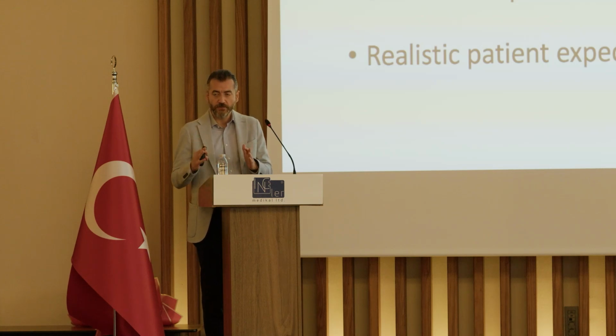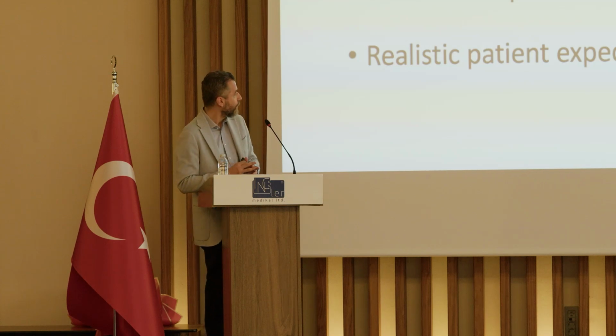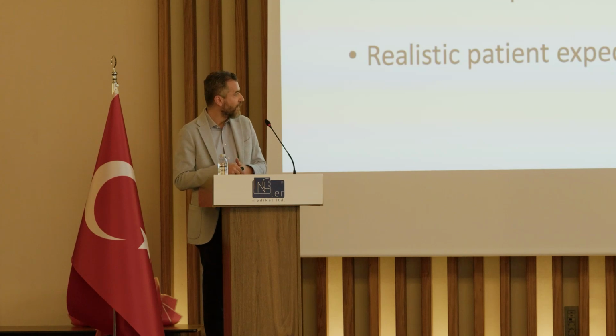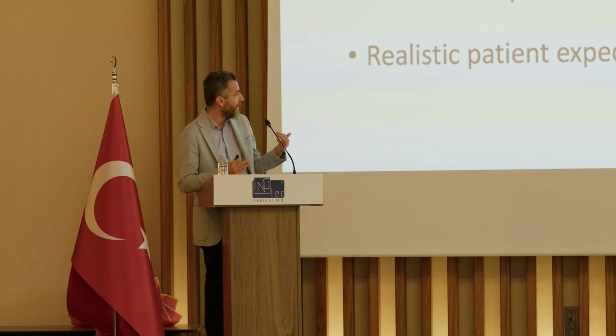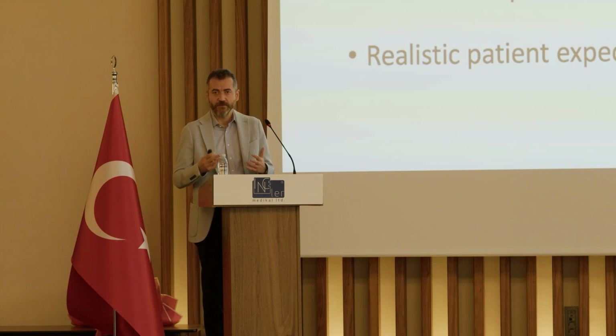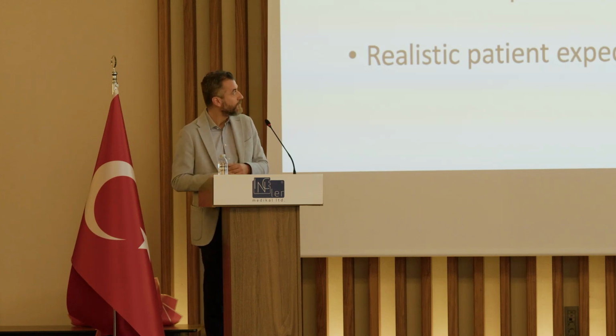So you should also operate with good technical details. Proper education of the physician who is going to apply the shockwave procedure is also important. And proper patient informing is important. You need to have well-informed patients who have really realistic expectations after the procedure. So it's not a major operation in the end. It's the application of a medical procedure, and the patients should know what they will face after the operation.